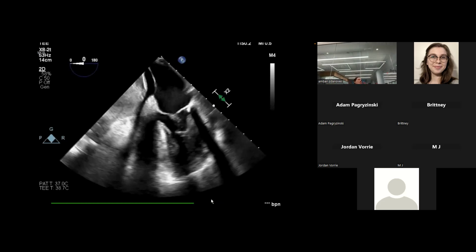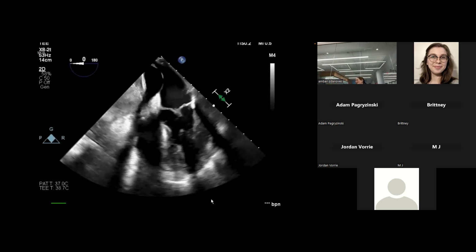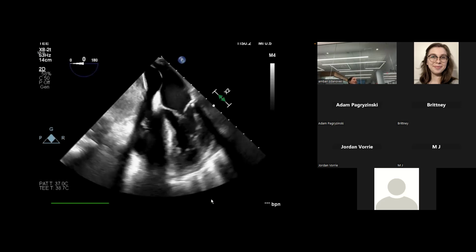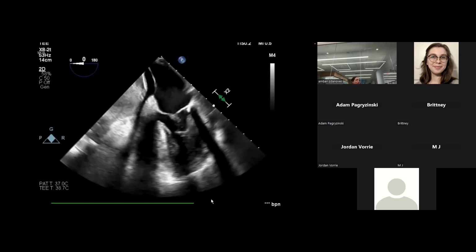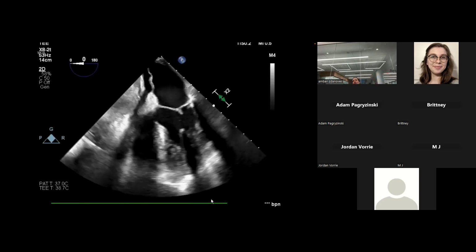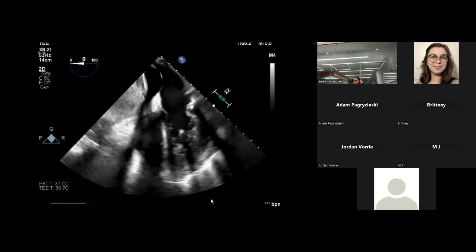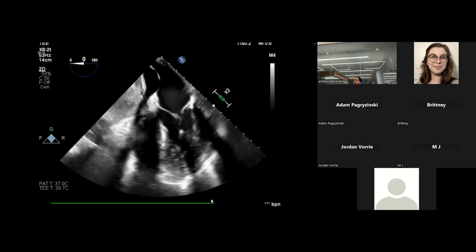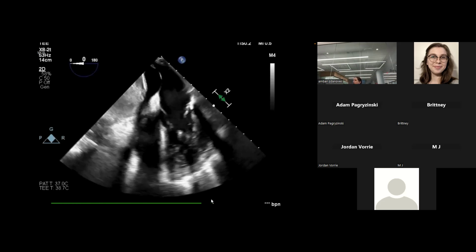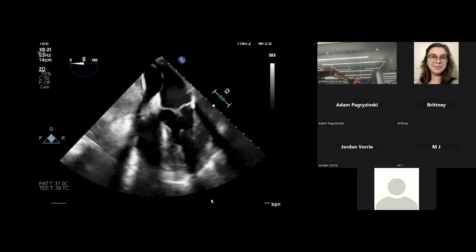So half the time when you're trying to figure out what's going on and you put the probe down, I look and I go, I have no idea what I'm looking at. And then you have to try to orient yourself. So in this case, what view should we be seeing if you put the probe down and you're at 0 degrees? Because a lot of views are 4-chamber. You could also be in the stomach, right? You could be seeing a mid-pap view if you were really deep, or really high up on the aorta. So kind of knowing those things.